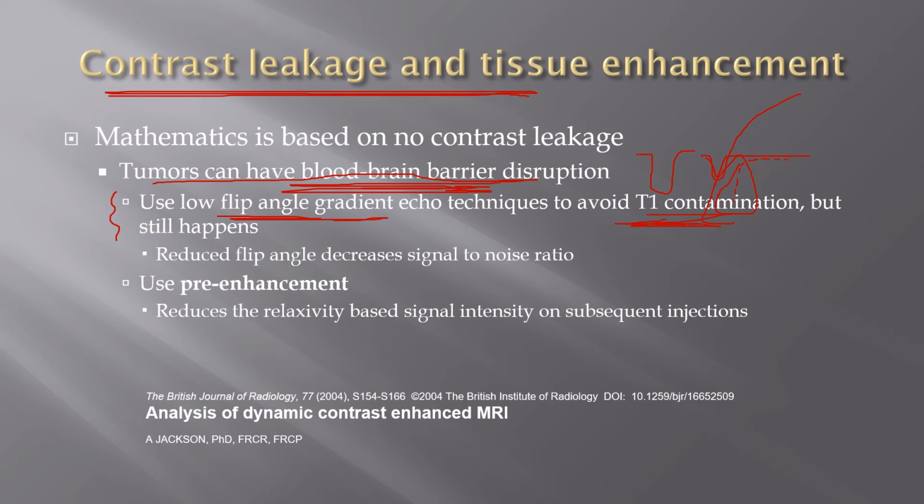what the true amount of perfusion is. It has been found, kind of interestingly, if you give some contrast first, so basically we split the dose, we preload with half the contrast, and that causes the contrast to leak out in the brain. And then when you give your second half and do your actual perfusion sequence, it doesn't demonstrate as much leakage. It actually markedly improves your view of the true perfusion extending through this lesion.